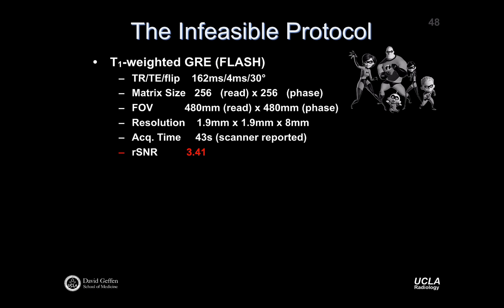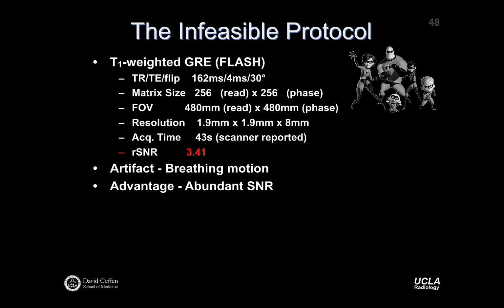I'm not saying this is a good protocol or a bad protocol. I'm saying it's an infeasible protocol. It's terrible, right? Mostly because the scan time is too long, and in fact, I don't think the resolution is that great either. So let's see what happens. What's going to be the problem? Well, patients can't hold their breath for 43 seconds, so you're going to have breathing motion.